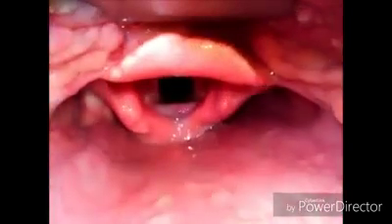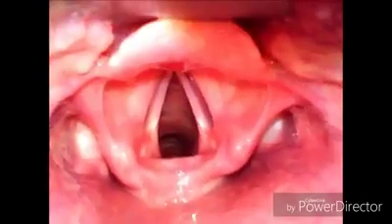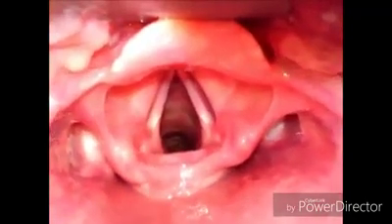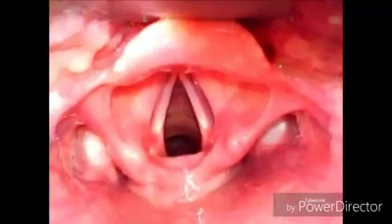As soon as you lift the epiglottis, you can see there is an opening for the trachea. This opening is characterized by the presence of vocal cords which are placed laterally, and in this opening you are supposed to introduce the endotracheal tube. Unless and until this opening is visible, you are not supposed to introduce the endotracheal tube.